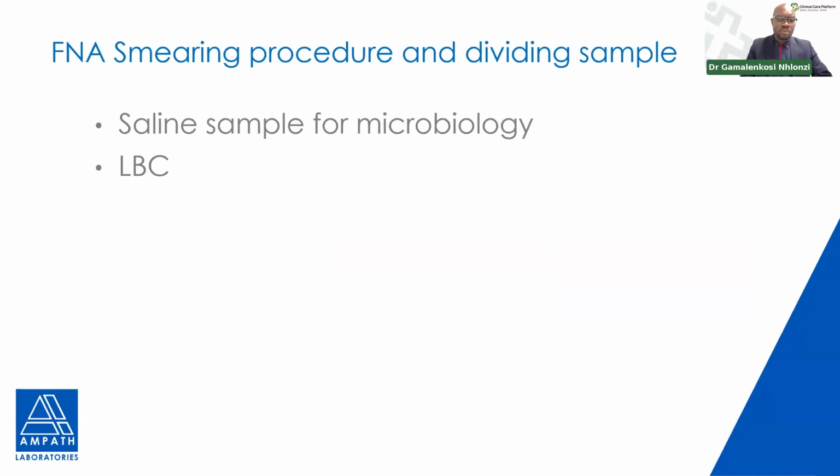So once you have finished putting in your smears, what you can also do, for example, if you want to submit a tissue for microbiology, is take the needle that you used for sampling, take whatever contents were inside the needle, and just rinse them in saline, and then submit that for microbiology.